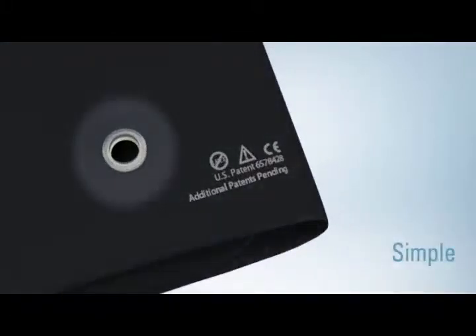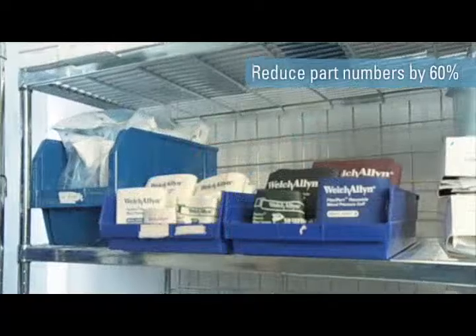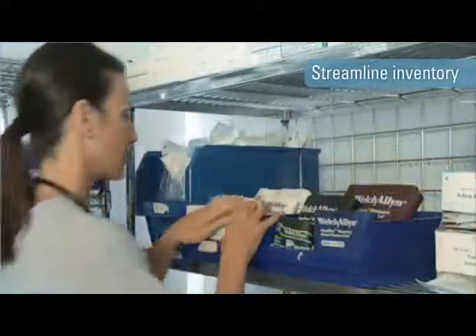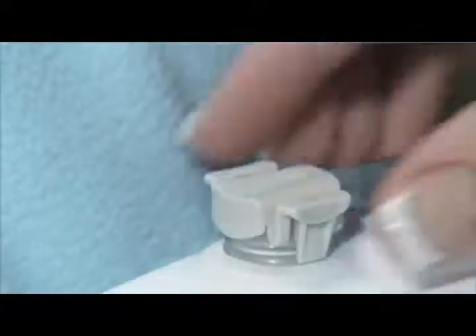Now there is a simple and truly standardized solution: Welch Allyn FlexiPort blood pressure cuffs — the first blood pressure cuff with a single point connection to reduce cuff complexity. FlexiPort cuffs are specifically designed to work on virtually all electronic and manual blood pressure devices, whatever the tubing configuration.